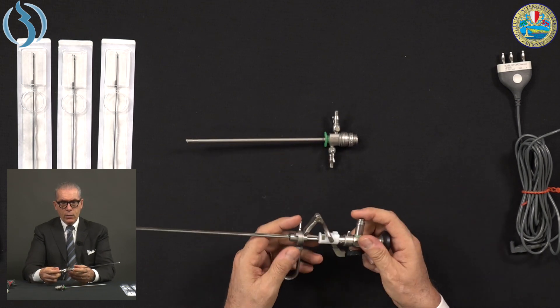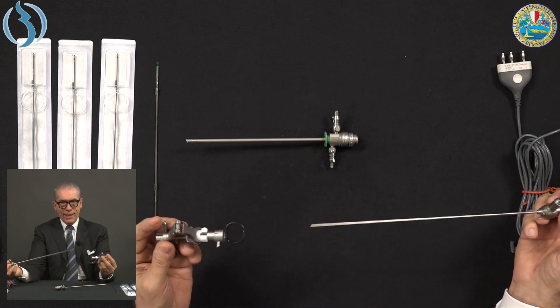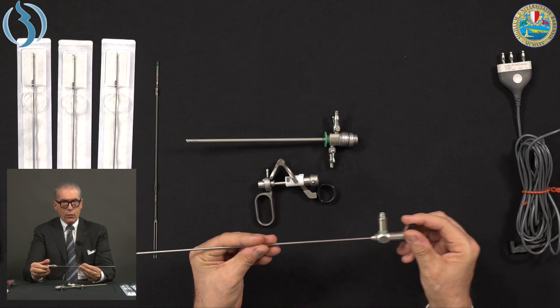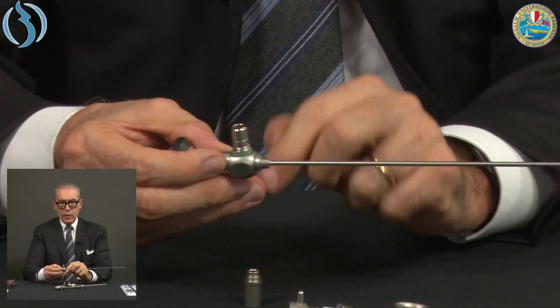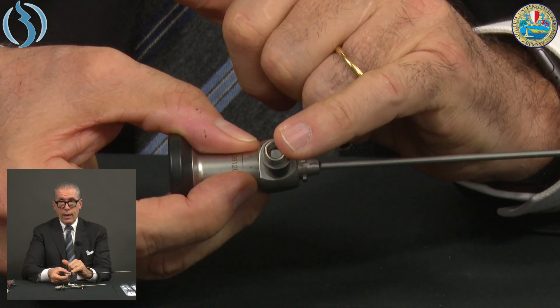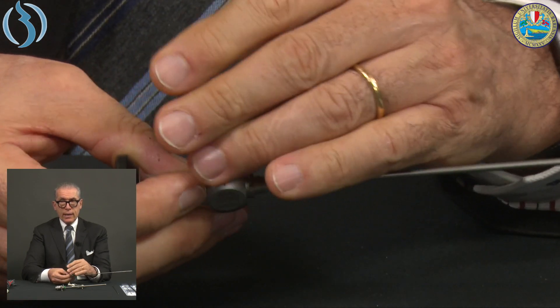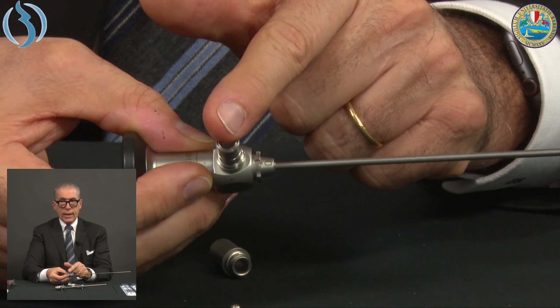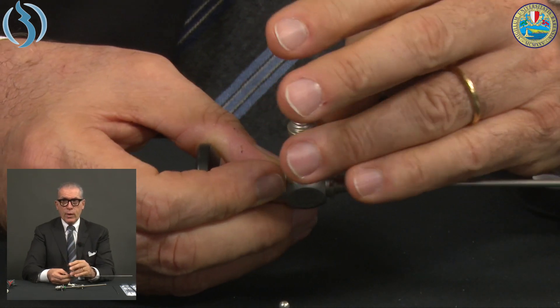Once the procedure is finished, immediately disassemble the resectoscope: remove the inflow, outflow, electrical cord, and light cable. Take the sheath out, remove and discard the disposable electrode, and immediately save the lens. Take the lens under water, clean it between your fingers with soap. Remove the external part of the light cable adapter to avoid creating a cavity where liquid or debris could remain and damage the light cable. This area must always be kept dry — reassemble only at the end of the sterilization process when everything is dry.